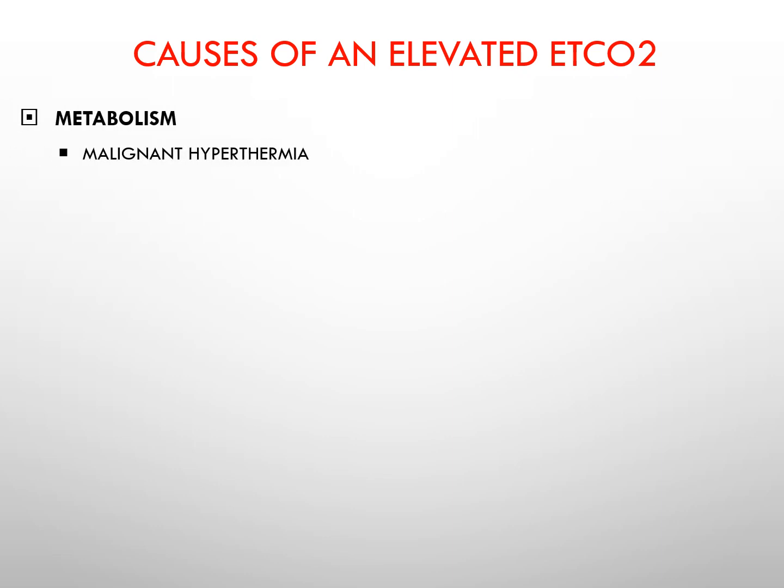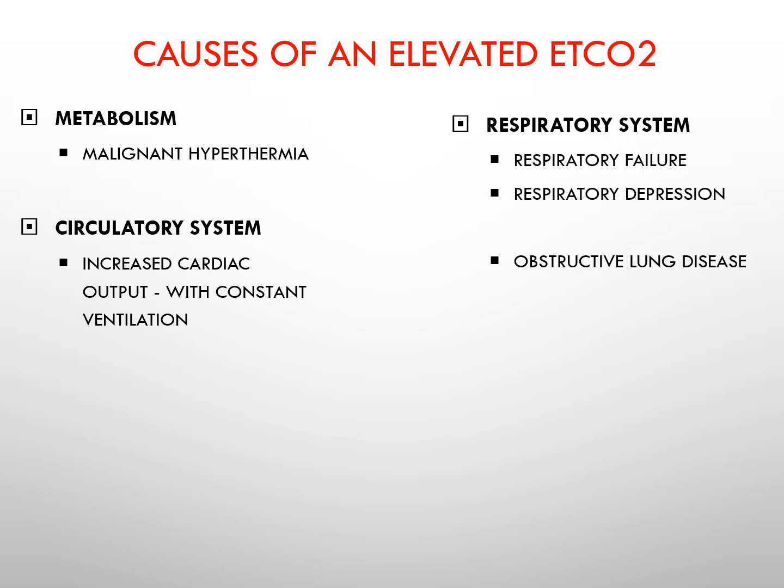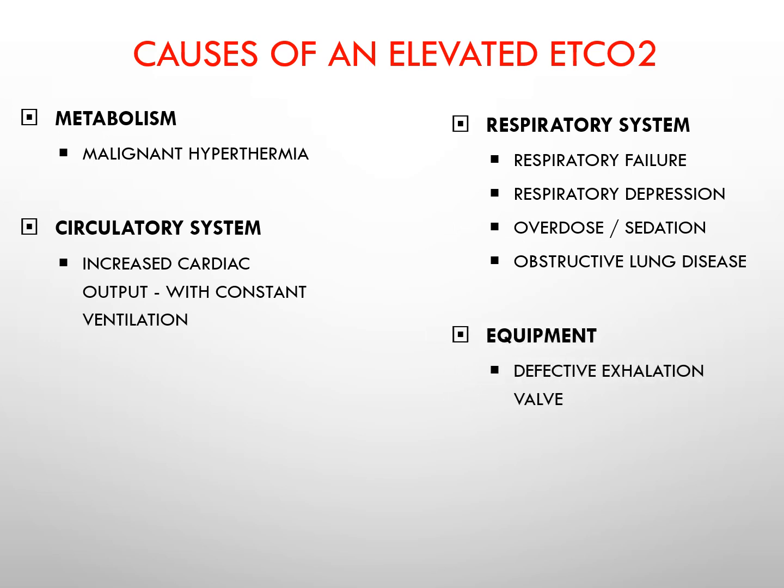So some of the causes of an elevated end-tidal CO2 are as follows. On the metabolic side of the equation, you could have a patient who has what's called malignant hyperthermia. So you have damage to the hypothalamus, so the body's thermostat is off. The patient is basically burning up. They're producing a lot of CO2, and that CO2 could be measured in terms of an elevated end-tidal CO2.